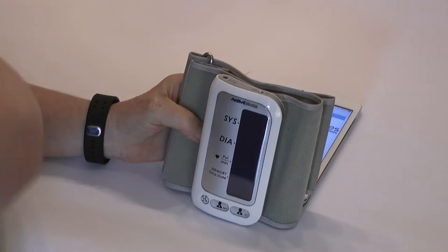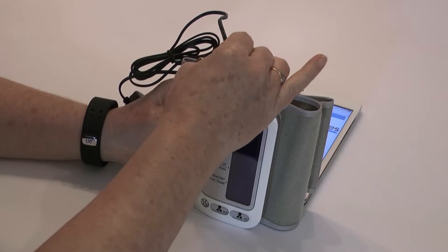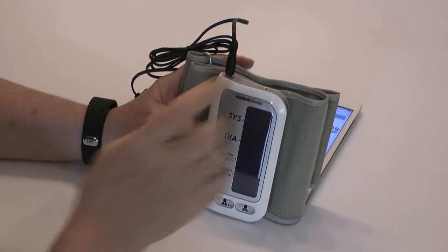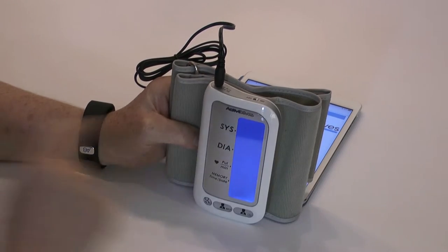The blood pressure machine can be recharged with one of the main connectors — choose the appropriate international one. Turn it on, but the screen will go blank whilst it's charging.